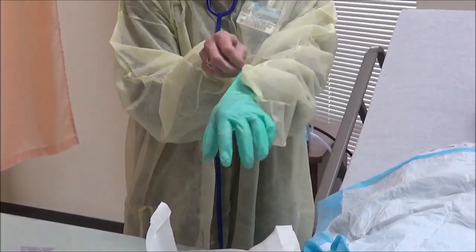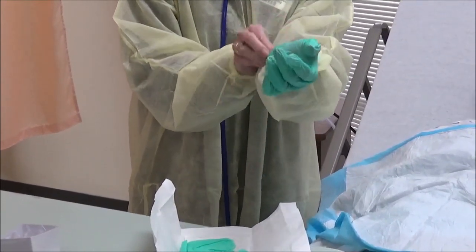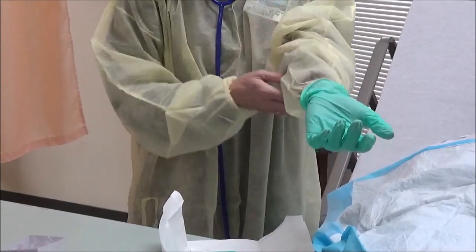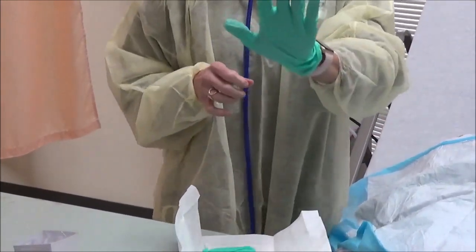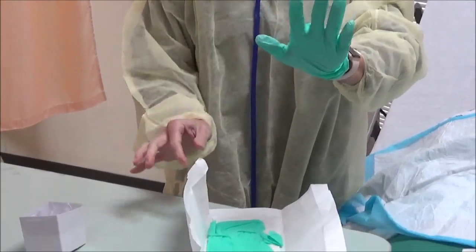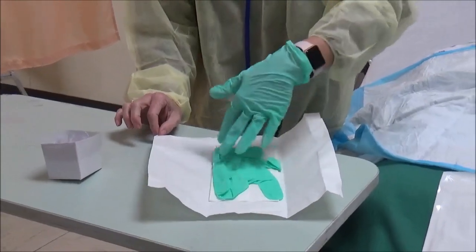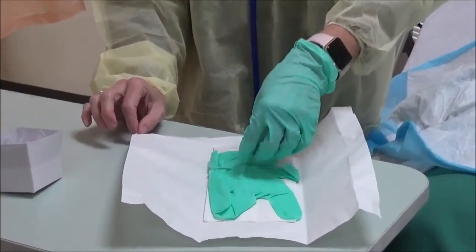But this back part of this glove now is contaminated because I have touched it, or any part that the gown touches on my glove becomes contaminated. I'll just scoop that up. Now, this hand is sterile. I can grab anywhere on this glove that I want to because I'm touching sterile against sterile.